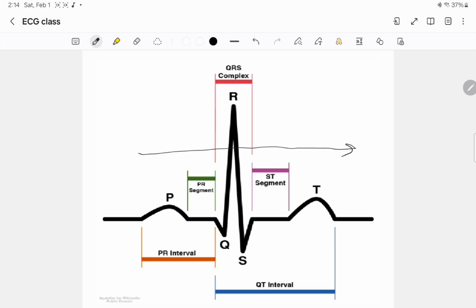Now, this video and the videos that follow are meant to be an introduction to concepts and will basically give you an idea of what's normal, but the information given won't be absolutely comprehensive. So we'll have to go into greater detail in future videos when we speak about, for example, chamber enlargement, ischemia, myocardial ischemia, and other concepts, right? So it's just an introduction, okay, and an approach.